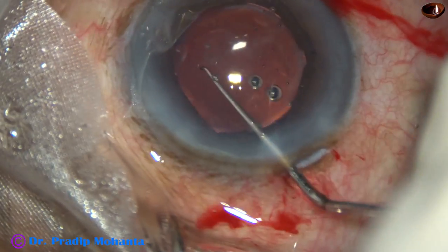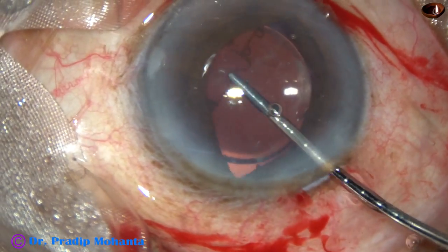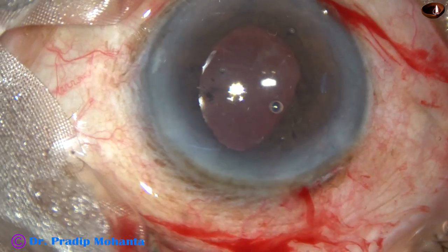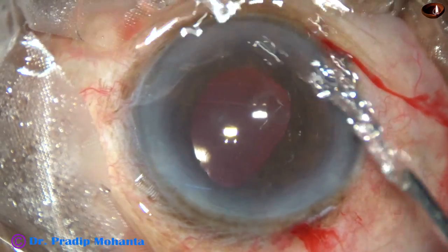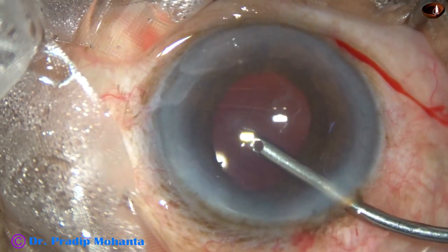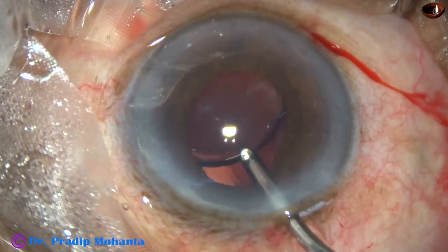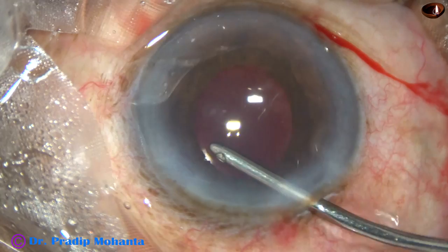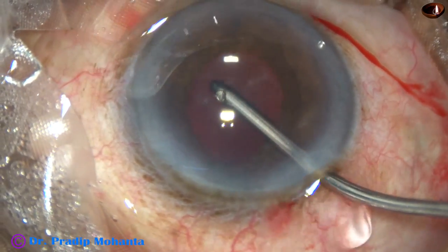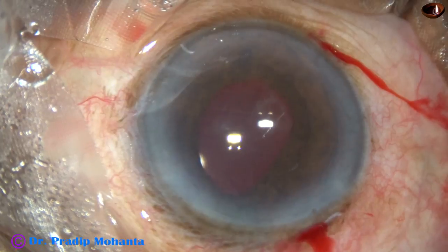A Sinskey hook dials the lens. Now I am removing the B-hex pupil expander — just untucking all the flanges and removing it. The pupil has taken an irregular shape because the pupillary margin at 10 o'clock was taken into the aspirating port of the phaco needle while making the first groove. The lens is rotated 180 degrees. The viscoelastic from the anterior chamber and capsular bag is removed with bimanual irrigation-aspiration.